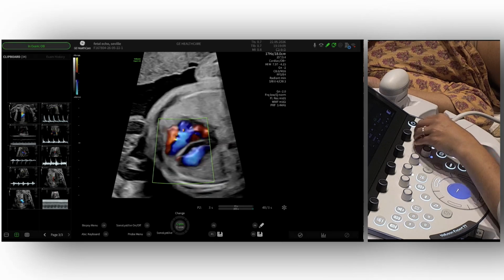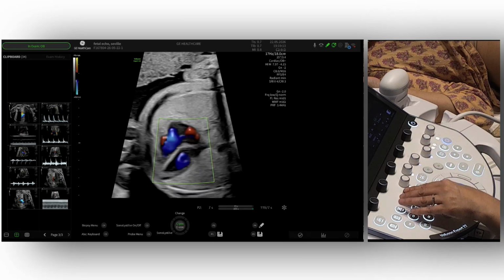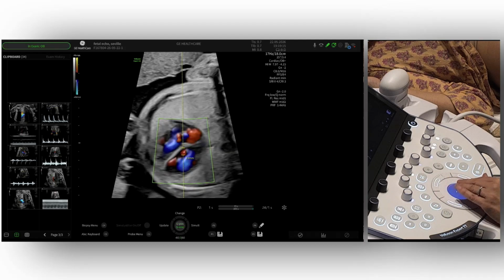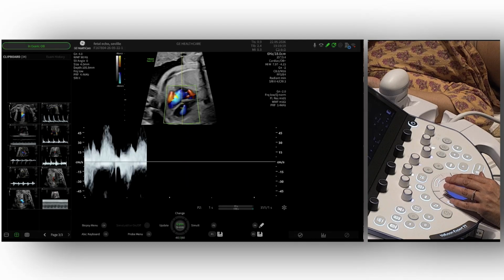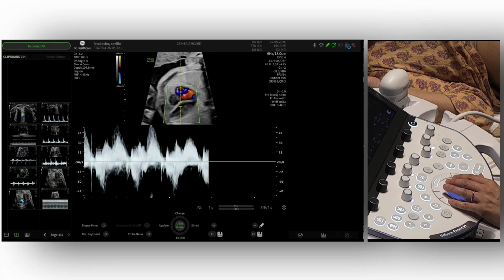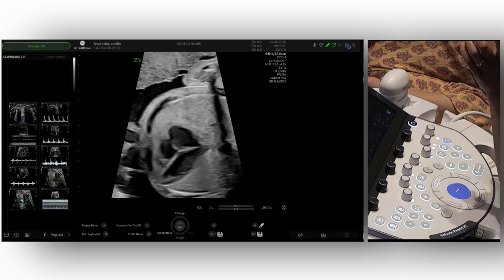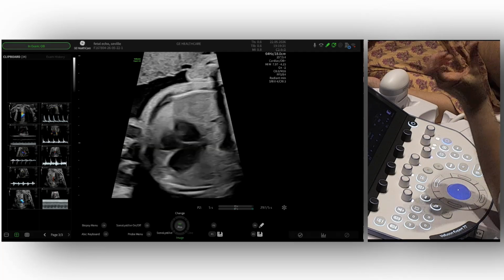And in terms of time intervals, do you refer to charts, or do you have on the ultrasound system the expected times in normal time intervals? Well, there are normal values, but it's mainly to see if, in the AV and VA relation, one is longer than the other.